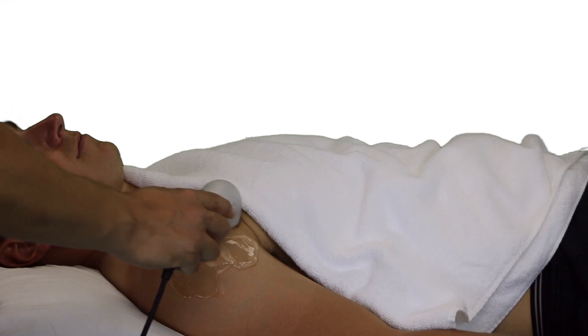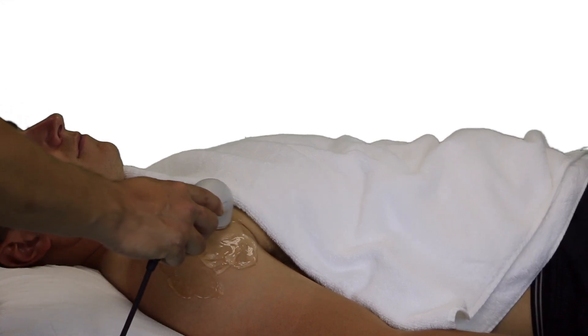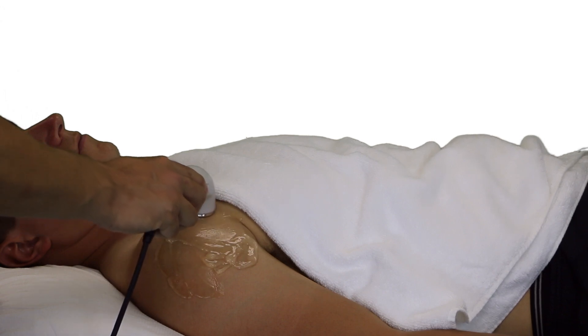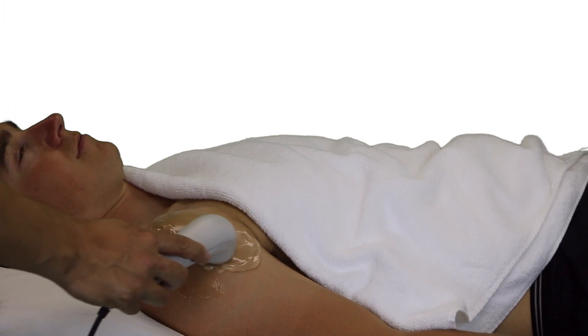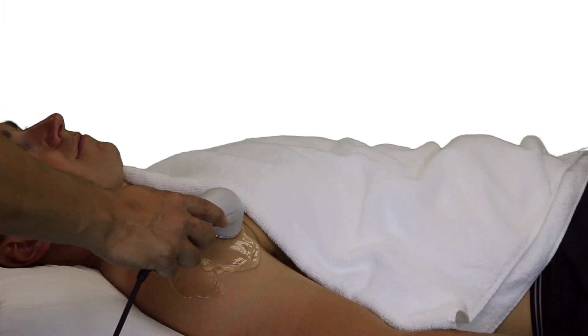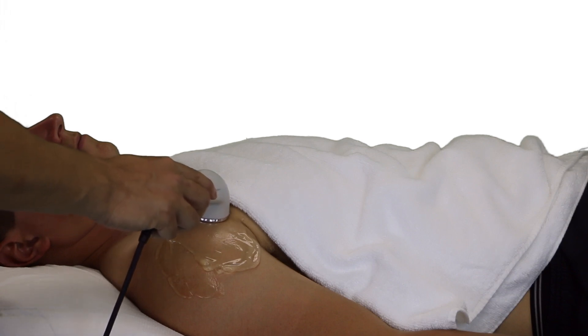After a minute or two, it's important to check in with the patient to ensure their comfort. If this is a thermal application of the ultrasound, it's important to ask the patient whether they feel the beginnings of a deep warm. If they do not feel any warmth, it is appropriate to increase the intensity of the ultrasound application.